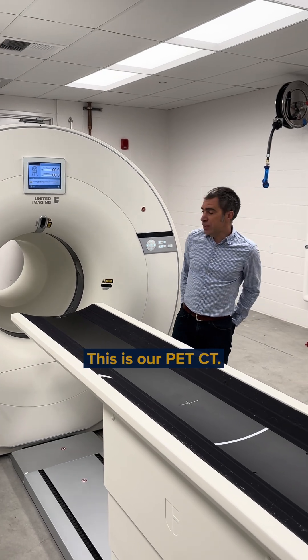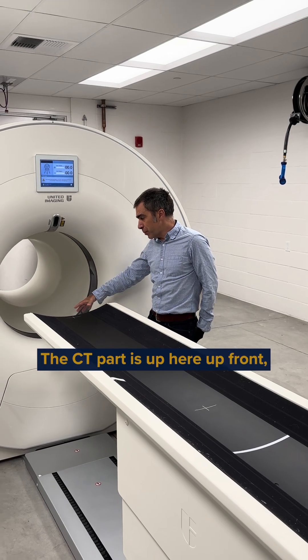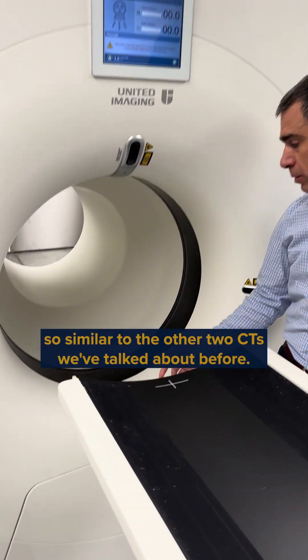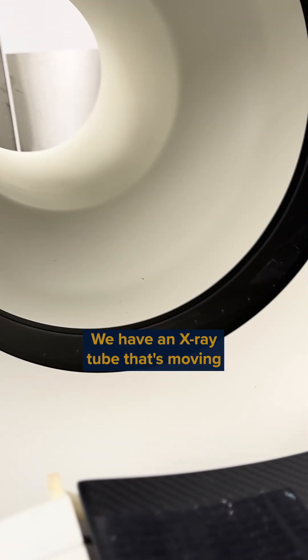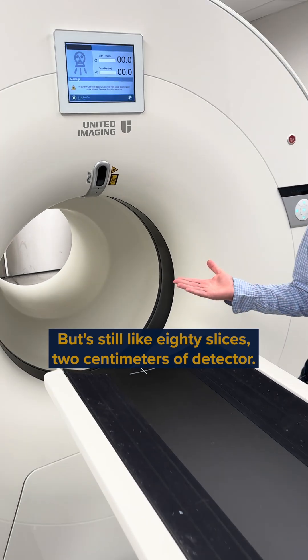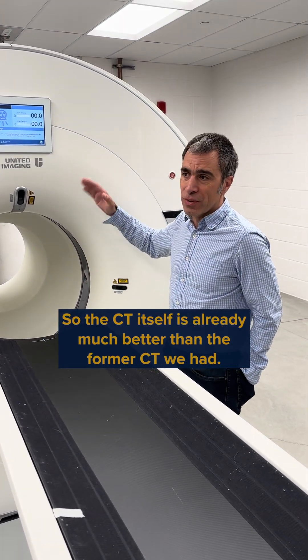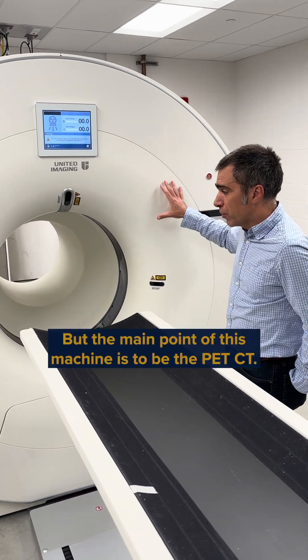This is our PET-CT — two parts: the PET part and the CT part. The CT part is up here up front, similar to the other two CTs we've talked about before. We have an x-ray tube that's moving and creating slices through the patient. This one is slightly smaller than the others, but it's still about 80 slices and 2 cm of detector, so the CT itself is already much better than the former CT we had.